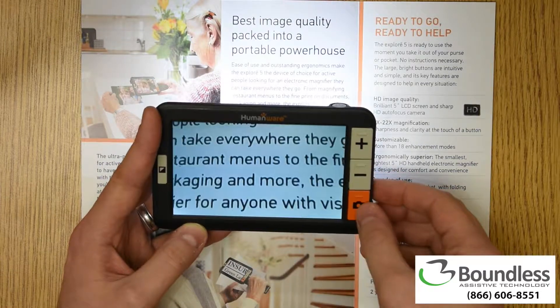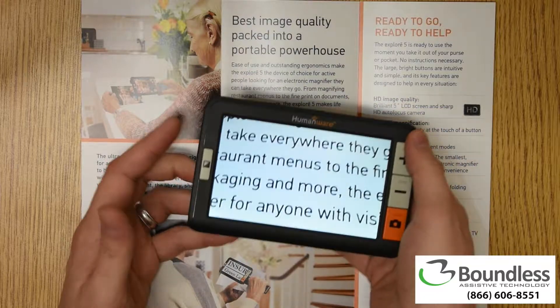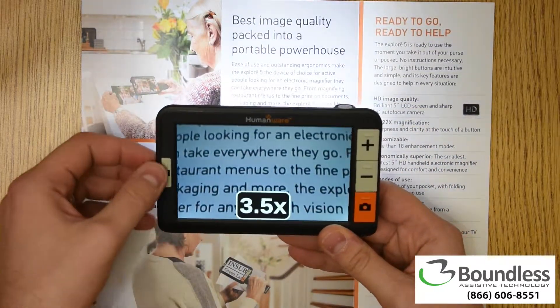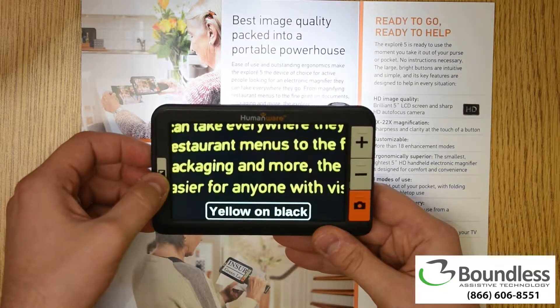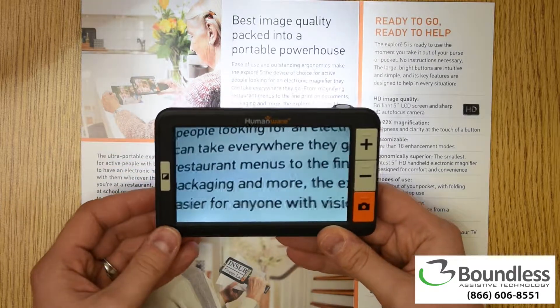Just below that, we have an orange button which will actually freeze the image so we can take some information somewhere else or save it for later if needed. On the left-hand side, we have a smaller button which we can press to go through the different color modes available to us — a helpful way to change the contrast depending on one's eye condition.